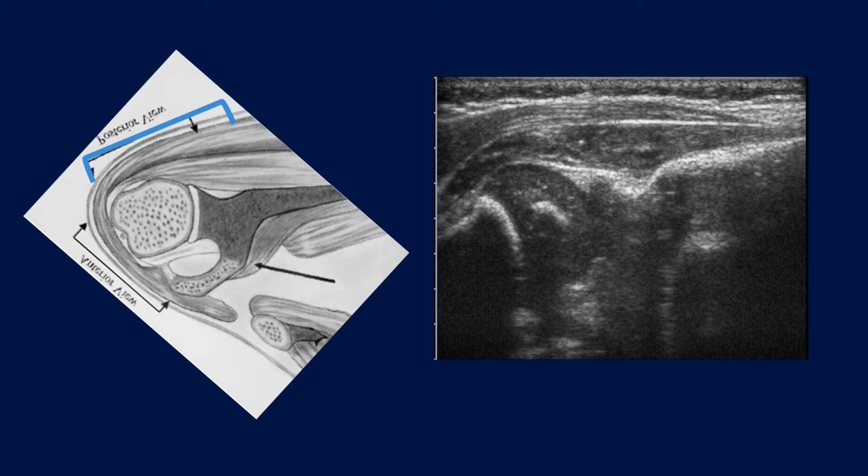If you turn the image that I just had upside down, the view that you get during the ultrasound is presented on the right-hand side of the screen, where we are visualizing the bony scapular wing as a bright echogenic linear reflector on the ultrasound. The glenoid cartilage is represented as a hypoechoic structure. The humeral head is also a hypoechoic cartilaginous structure, and in this example there is ossification of the proximal humeral growth center.